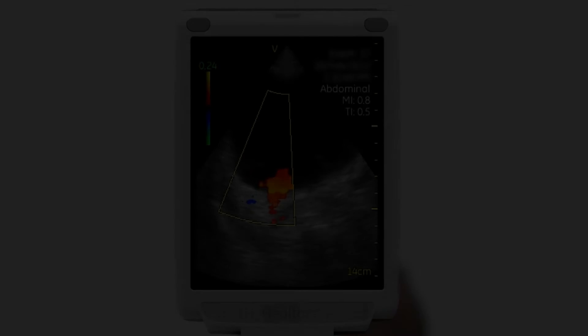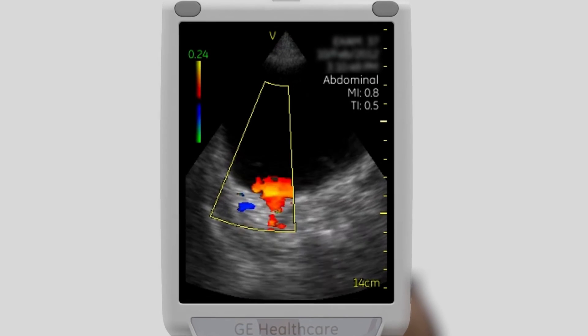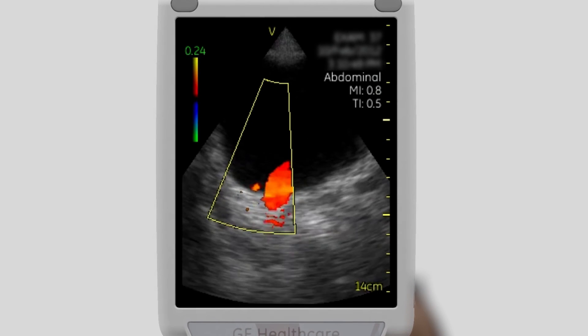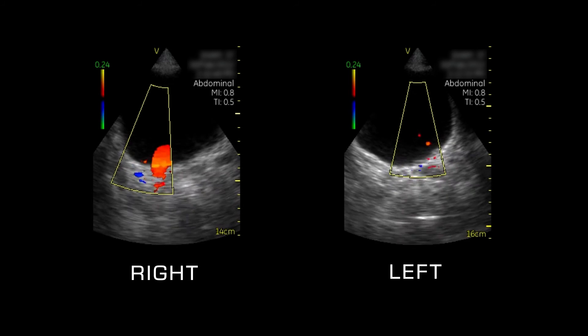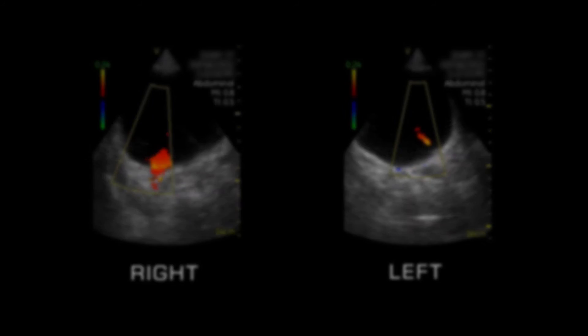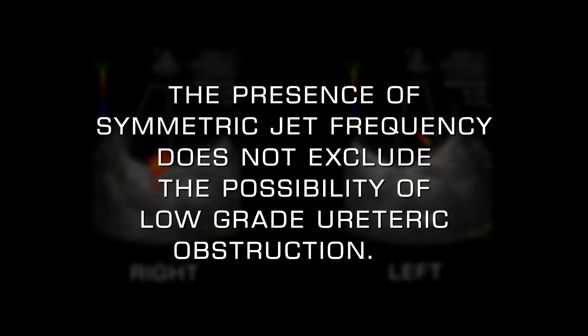Activate color flow mode to visualize the ureteric jets where urine is entering the bladder through the uretero-vesical junctions. The jet frequency is variable but should be symmetric. Unilateral absence of a jet can be a sign of high-grade ureteric obstruction on the affected side. However, the presence of symmetric jet frequency does not exclude the possibility of low-grade ureteric obstruction.